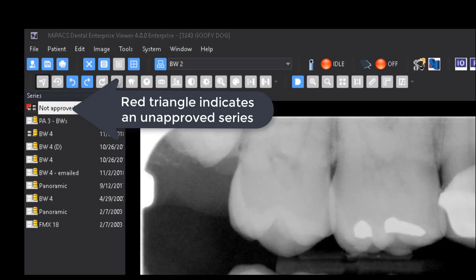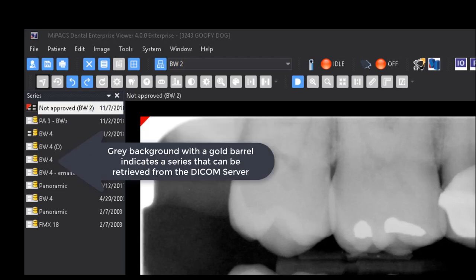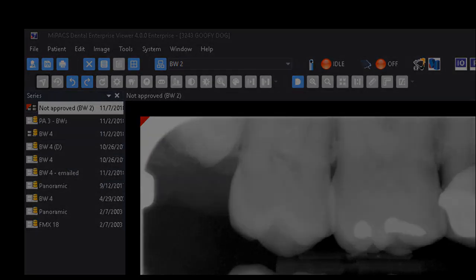A red dog ear indicates an unapproved series. A black background with a gold drum indicates an approved series that has been permanently stored to the DICOM server. A gray background with a gold drum indicates a series that can be retrieved from the DICOM server.